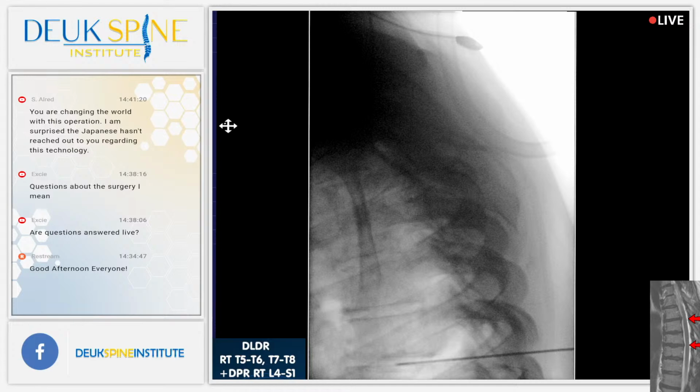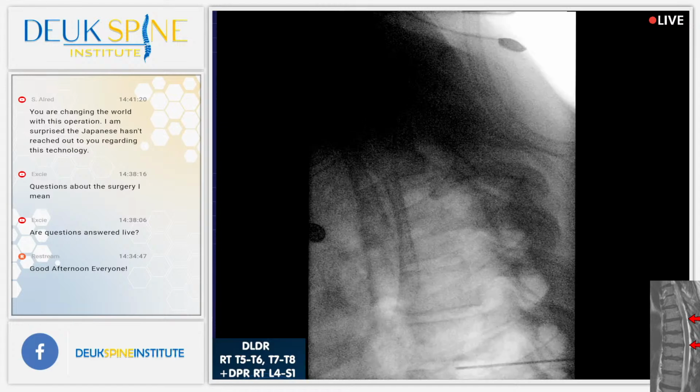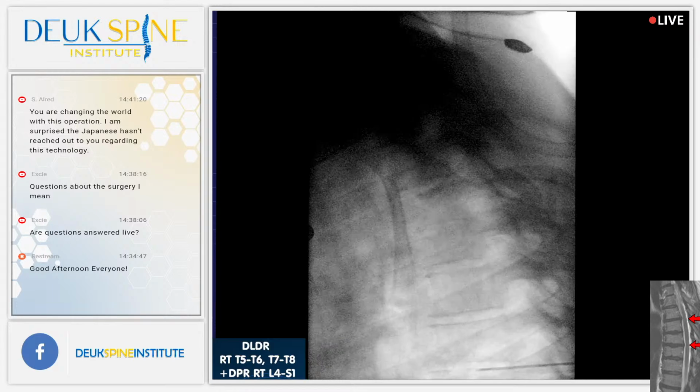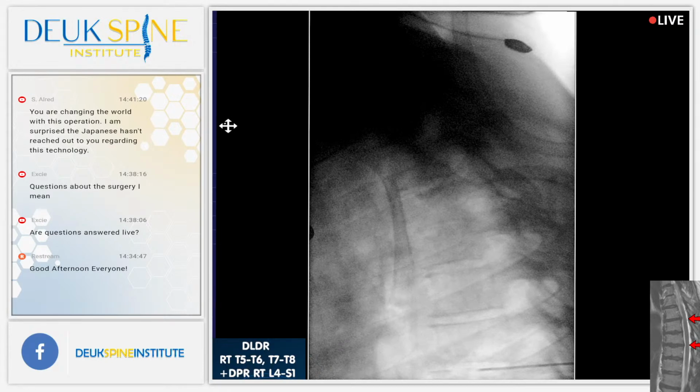What we're doing, folks, as you're watching, is getting the disc lined up properly with the fluoro. And here's why. The fluoro is what guides us. If the fluoro information is wrong, we will never get to the disc. I think you're off on orbit, but you definitely got a good wag. Your wag was much better. You're not far off on orbit either. That's pretty good right there, Jordan.